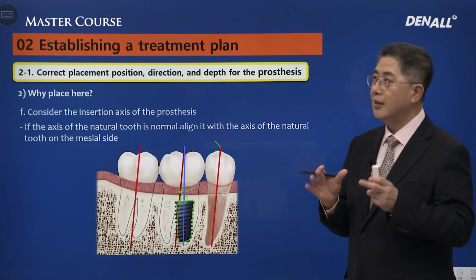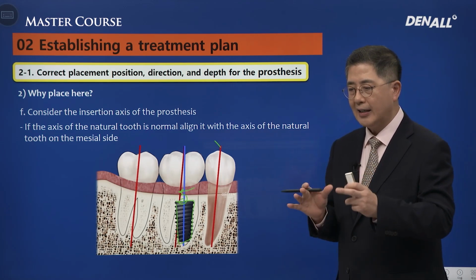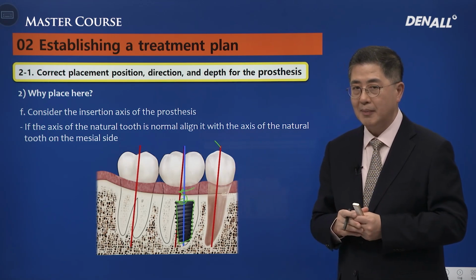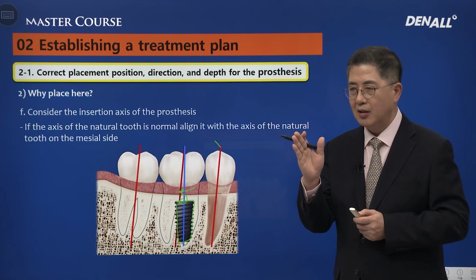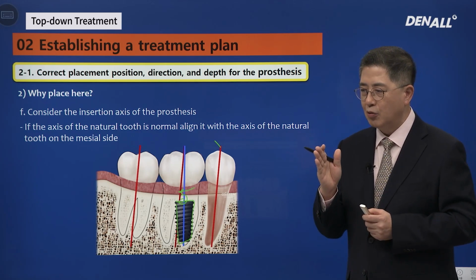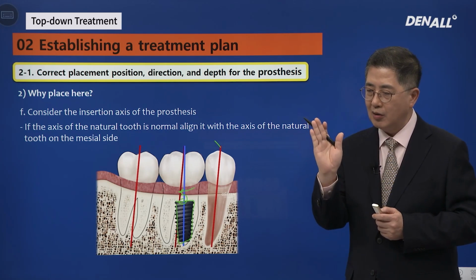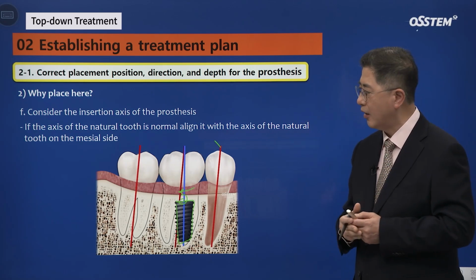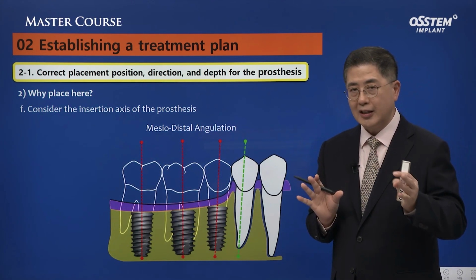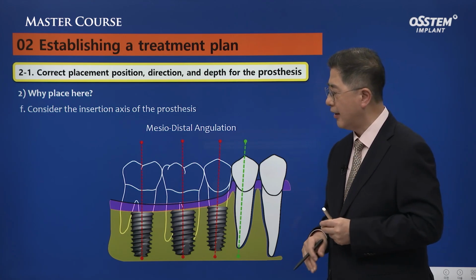When placing multiple implants, as in the case with missing teeth number 45, 46, and 47 in the lower, the approach differs. In the mandibular left and right first molar areas, teeth number 36 and 46, targeting the septum isn't always the optimal choice. Slightly distal orientation through the mesial root can yield a more natural outcome for the patient.